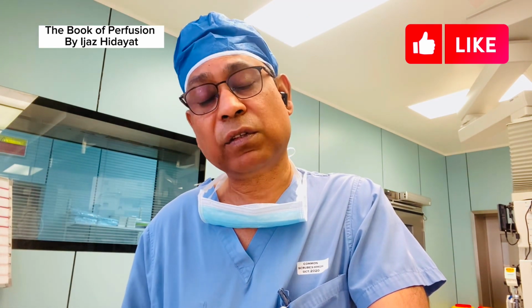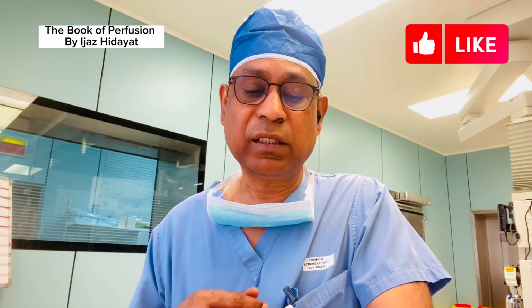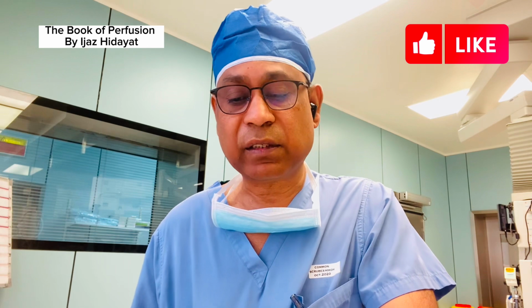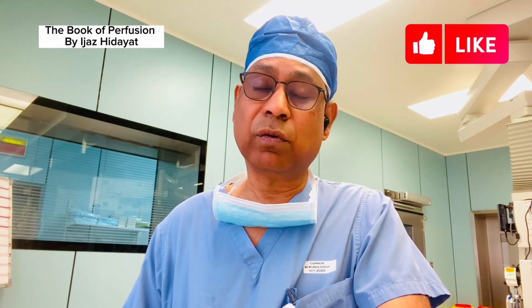We advise that we always use hemofiltration. During the procedure, we always use hemofiltration, like conventional ultrafiltration if the lungs are wet. We use zero balance filtration also.